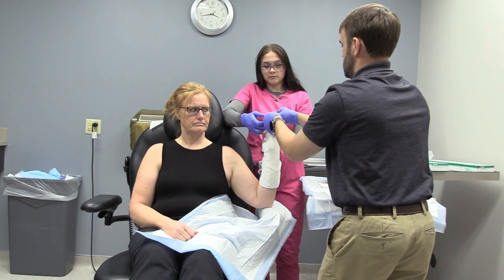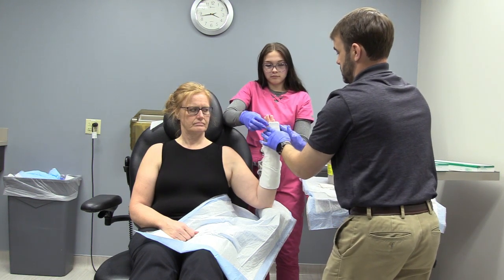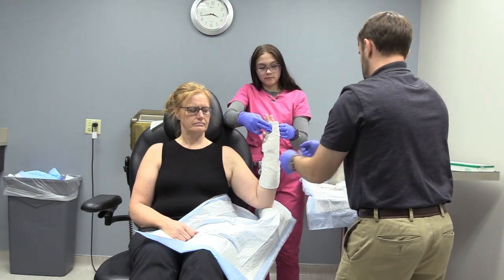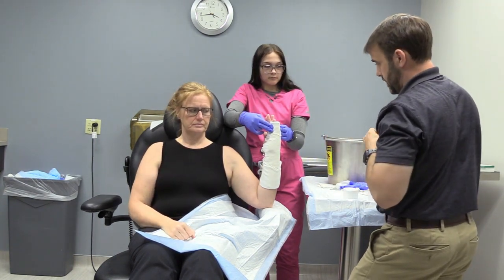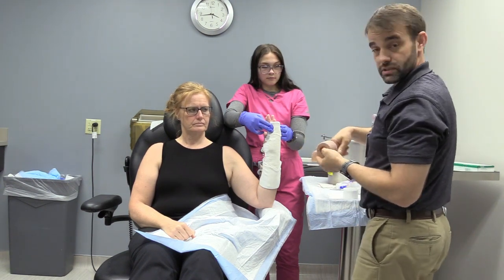Same thing on the fingers here. Just bring those down. And now it basically stays on its own, so you don't have to worry about your plaster falling. And I always take my gloves off once I get to this point, because otherwise you get plaster all over your Coban. I use Coban because I just find it's easier to secure stuff with it.